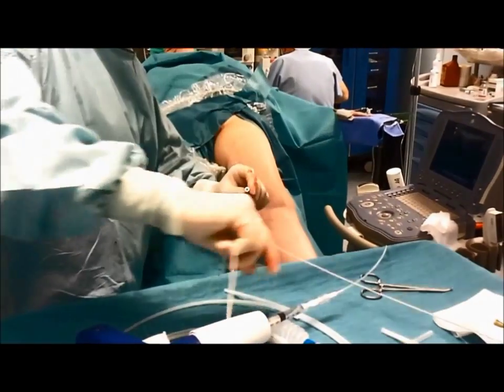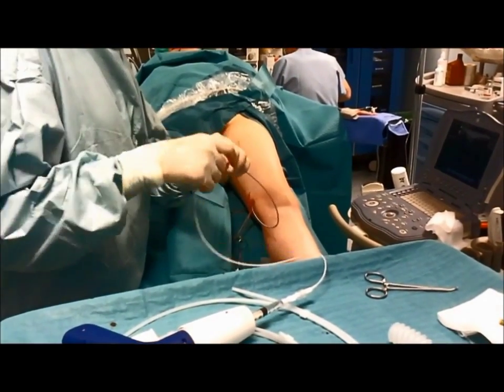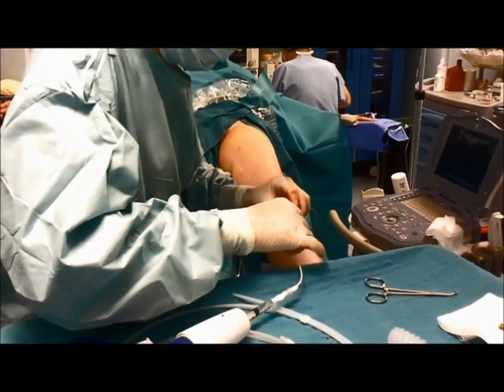It's a walk-in-walk-out procedure. No tumescent anesthesia is administered, as the procedure is completely painless and comfortable.